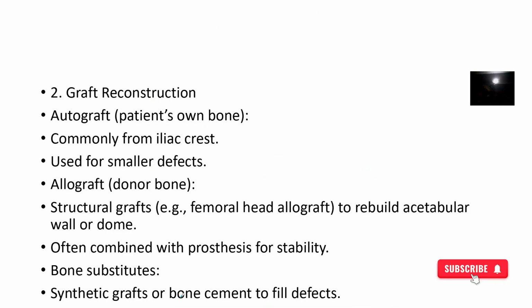Then there is graft reconstruction, like the patient's own bone. They can take it from the iliac crest for smaller defects. Or allograft, where there's a bone donor. It's often combined with prostheses for stabilization.